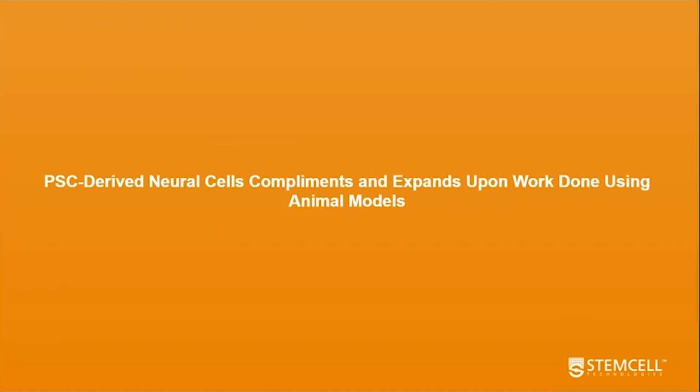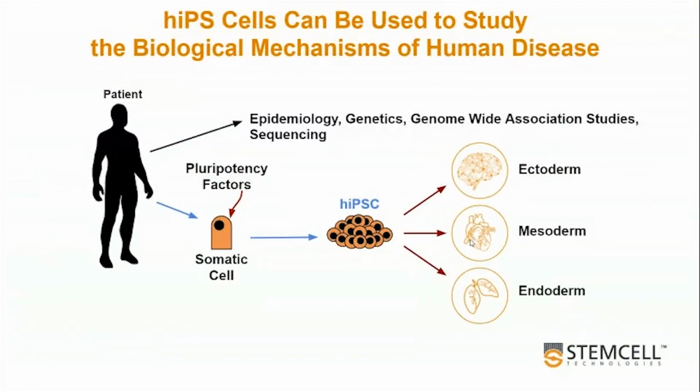Okay, let's start off with a bit of discussion around the importance of PSC quality. We know that iPS-derived cells are very useful for disease modeling. This is true whether you are struggling to work with human primary tissue or can't find an animal model that could capture certain disease phenotypes, or you are in need of some human-relevant data to support your path to the clinic.